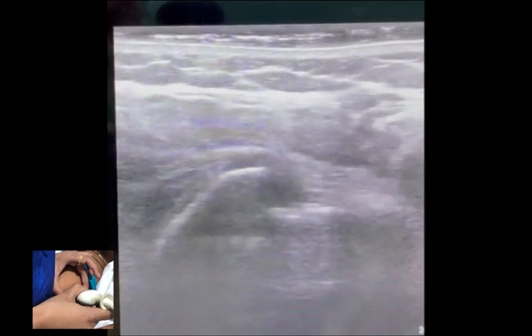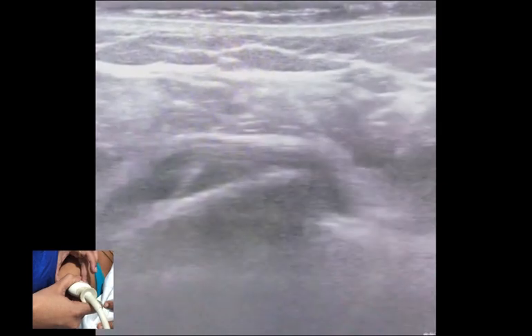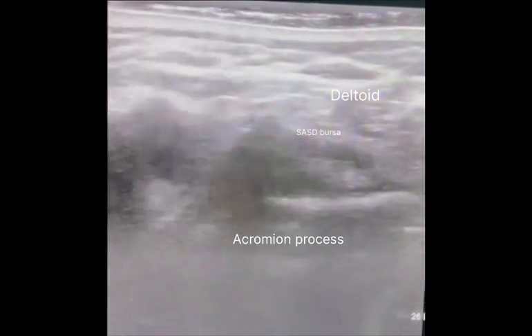the scapula, and it is an important landmark to identify the subacromial subdeltoid bursa. This can be inflamed in conditions like rotator cuff tear. Shoulder joint injections can also be done here, and injection of steroid or PRP in the subacromial subdeltoid bursa can also help in the treatment of rotator cuff injury and pain.